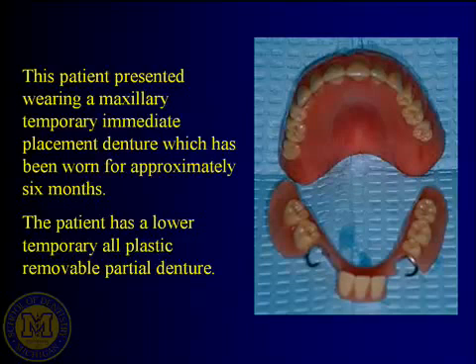So if we see this patient, we would make the presumption that this patient came in with lots of teeth in the maxillary and or mandibular arch bombed out, couldn't be restored, patient didn't have the money. Whatever the combination of reasons were, it was decided that this patient would be treated with an upper immediate placement stay plate and a lower immediate placement temporary flipper or temporary partial denture. So the patient wears this. We do any soft relines or temporary relines as needed. 4 to 6 months of time passes. We've got disease control pretty well taken care of.